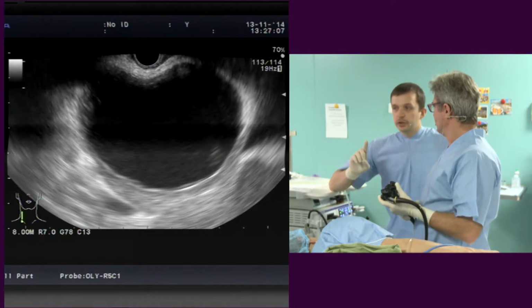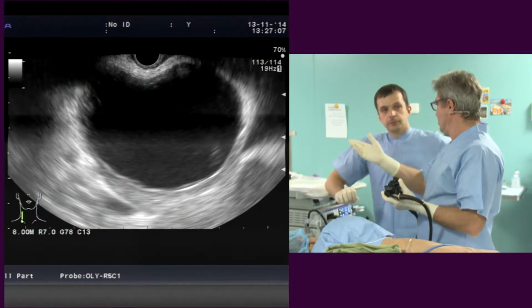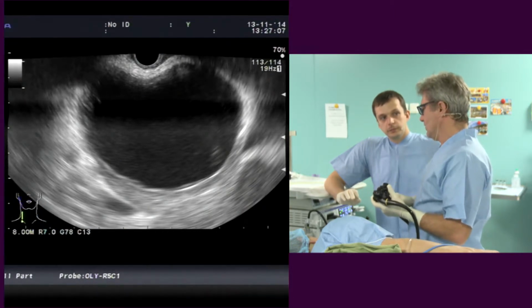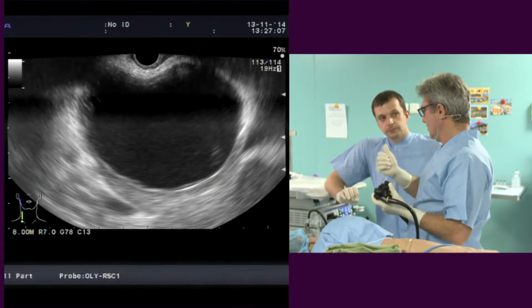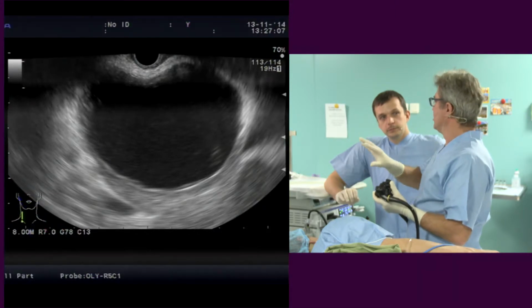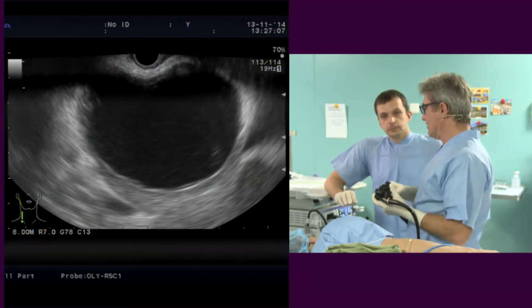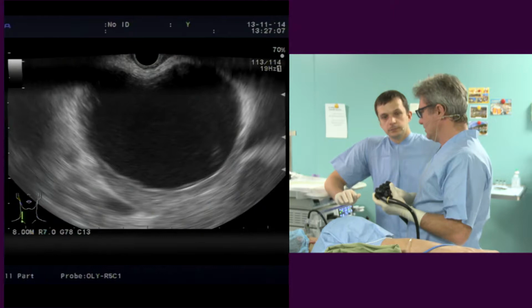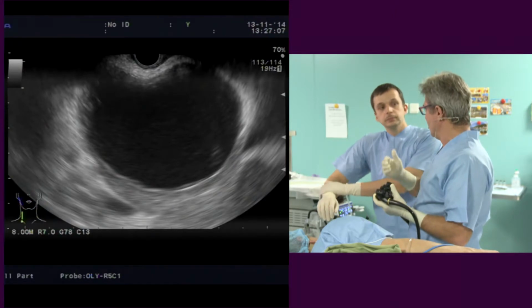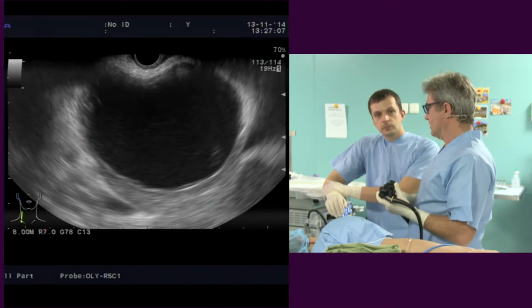First of all, can we use here the Atlanta classification of this cyst? Yes, this is a pseudocyst. So in Atlanta, the revised criteria, there's a classification in 4 entities that are pancreatic pseudocyst, acute pancreatic fluid collection, where basically the wall is not formed yet. And for example, we have a series in which we started treating these patients, even though it's not recommended, but sometimes there are very sick patients who are at very high risk for surgery, so we start treating these patients too.